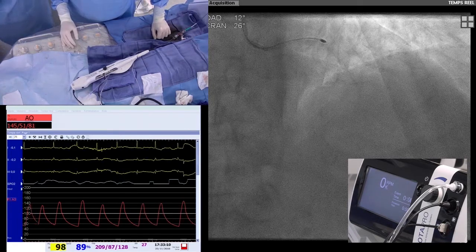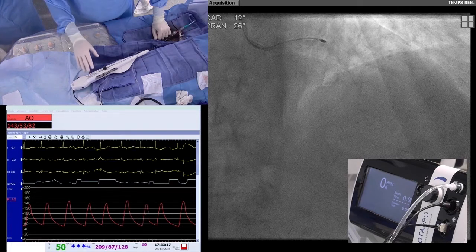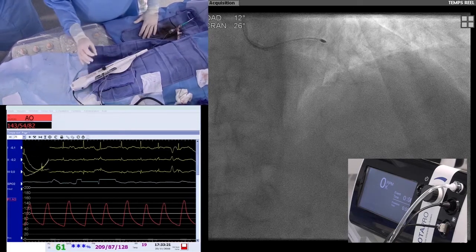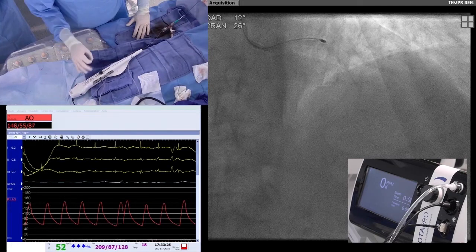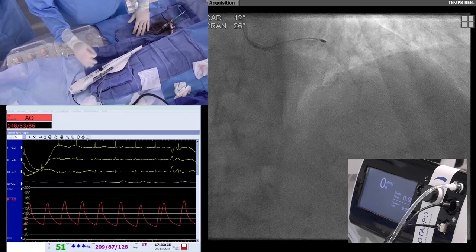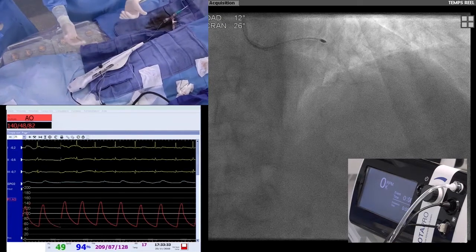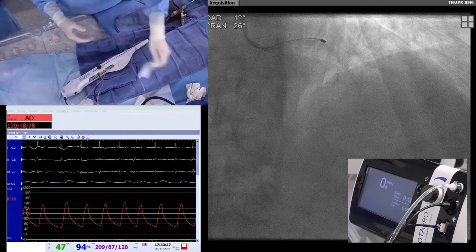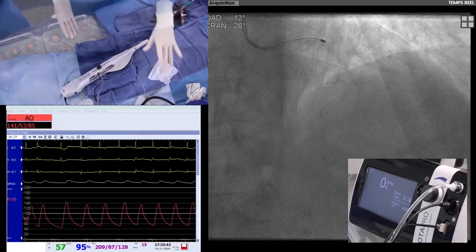You also have to listen to the sound of the burr. One advantage of the new ROTAPRO, I think, is that you are doing everything with your right hand. So you have to pull back the burr first, and then you stop. Sometimes with the pedal, you can do both at the same time, and you can stop the burr from running. Yeah. And this increases the risk of burr entrapment, I think. So maybe it's a good option.